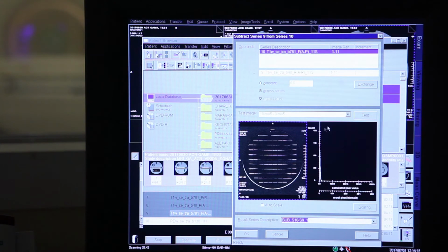There is a slight shift, but it's not as much as this one. With this mesh structure, we are able to measure homogeneity in all in-plane directions. In the middle, you do not expect big shifts. At the edge of the phantom, you expect a shift.